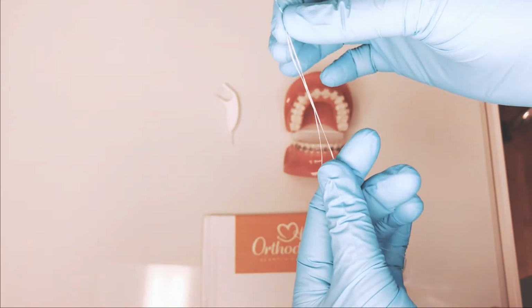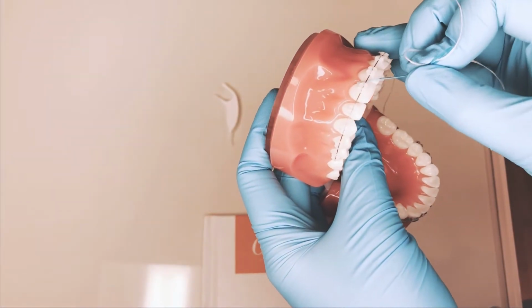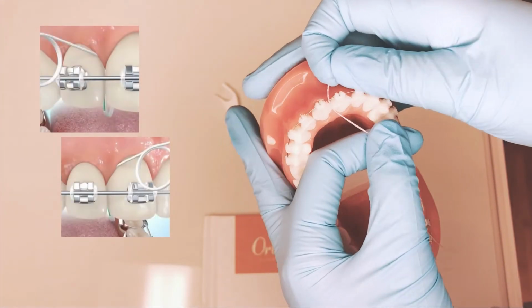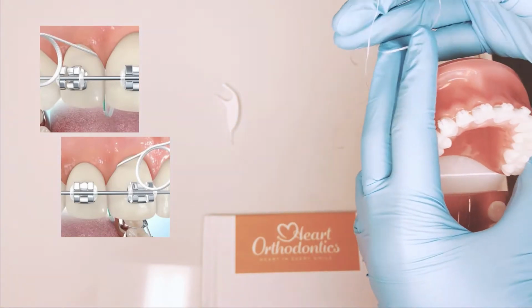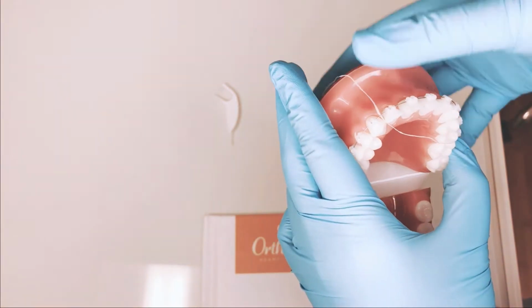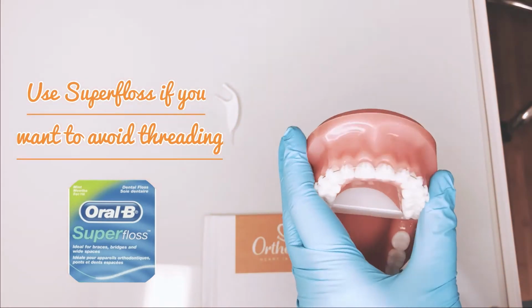Pass it underneath the wire, then floss to the contact. Use good technique. Curve it to both sides and let it go a little bit below the gums. Don't forget to pull the floss out towards the front to remove it. Super Floss has a stiff end built in already, so no threading is needed.